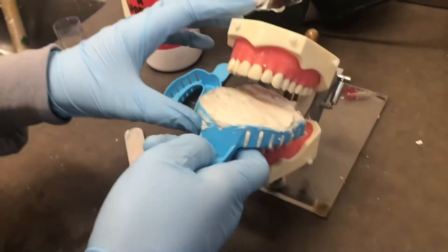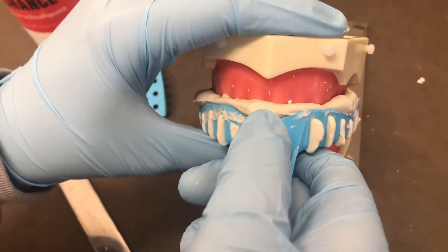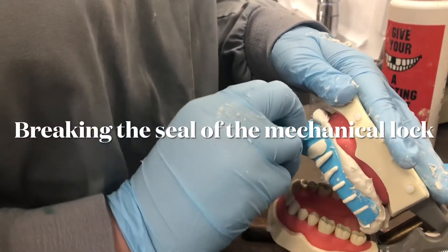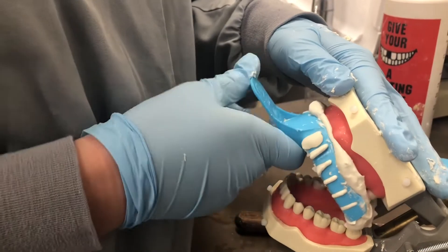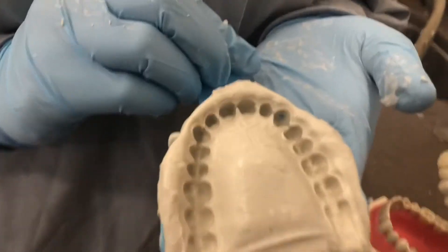After filling the tray, you're going to put it onto the maxillary. Now that it's dry, you can take it off. Here's your maxillary impression.